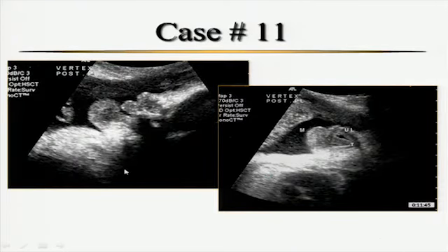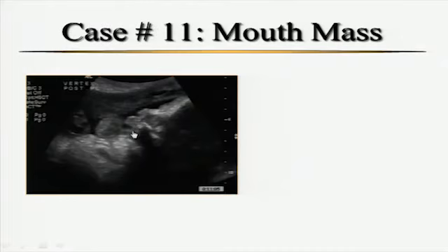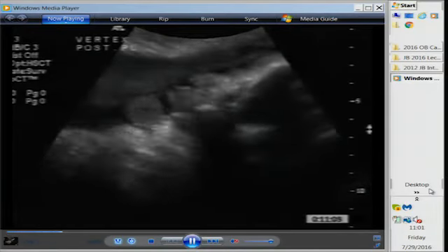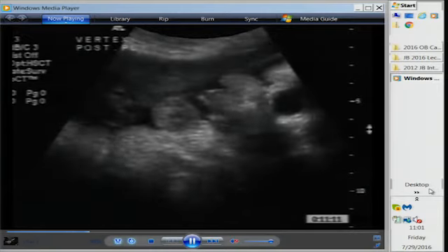So let's look at a little profile. Little nose, upper lip, lower lip. Now this is kind of like a semi-coronal through the face. It took forever for this child to turn. But looking at upper lip, lower lip, and then this little thing. So unless they're sending pacifiers in now at conception, that shouldn't be there. It took like 20 minutes to wait for this baby to actually start sucking. You can see it looks like the baby's sucking on a big old pacifier.